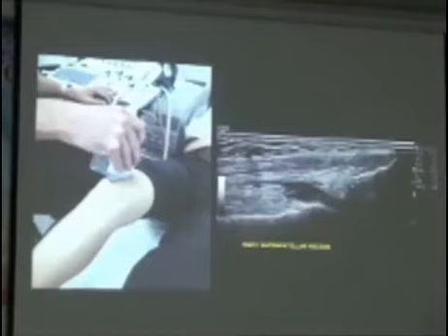And we've got the quadriceps tendon coming up here onto the patella.